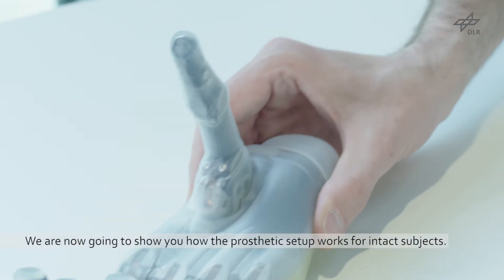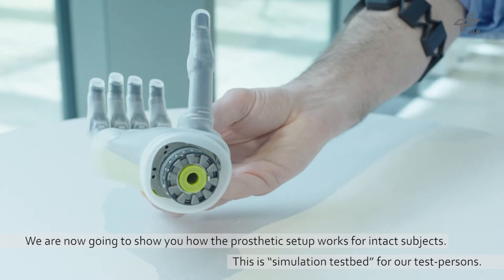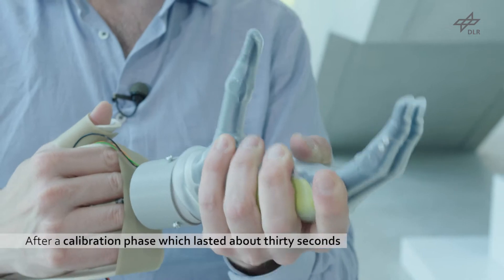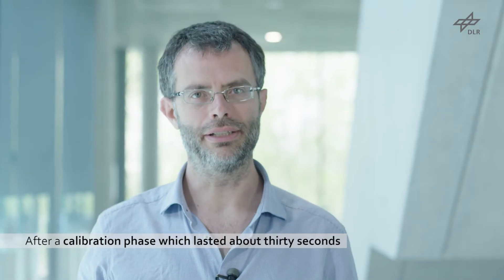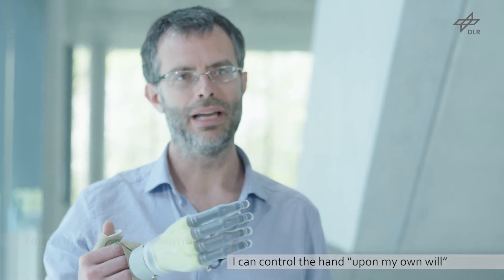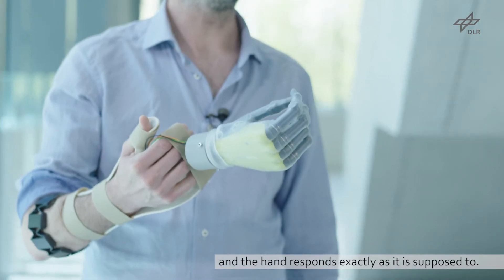We're now going to show you how the prosthetic setup works for intact subjects — this is almost like a simulation of our test persons. After a calibration phase which lasted about 30 seconds, I can control the hand upon my own will. I contract my own muscles and the hand responds exactly as it is supposed to.